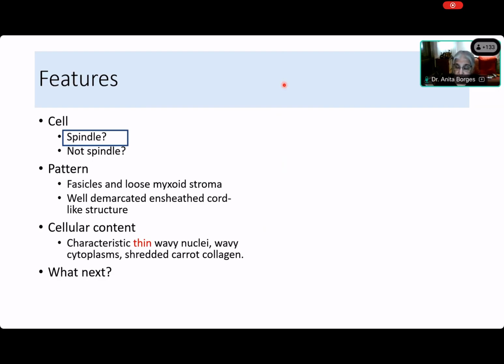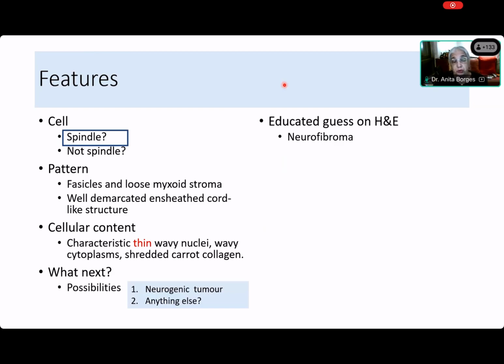Now, what next? What do you want to do now? Kedar, what next? We've written the description. We've done everything. Differentials, ma'am. Okay, give differentials. What are your differentials? One, it could be neurofibroma. I see. And could be schwannoma as well. Okay, it's a neurogenic tumor. Could it be anything else? And the answer is, if you make an educated guess, it is a neurofibroma. It cannot be a schwannoma.